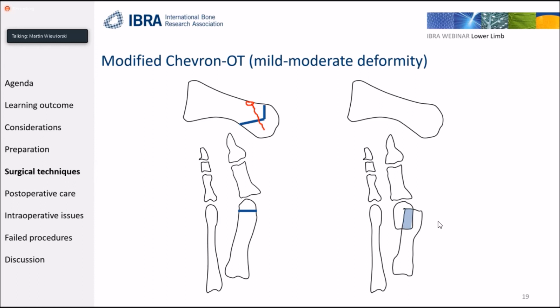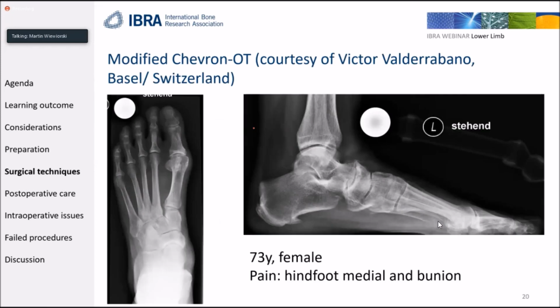It's a double thread, and you can sink them in the bone. And here, looking from above, basically, there's ways to do this. I mean, if you have enough space here, you can put them here in a parallel order. Or if you don't have enough space, I've done it before, you can put them basically sequentially. So looking maybe from this view, like two screws in a row, which usually allows a sufficient fixation in this kind of posture.